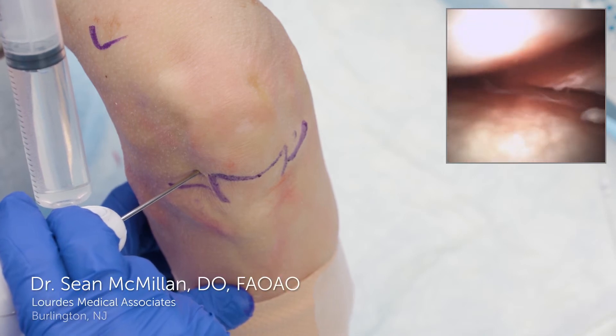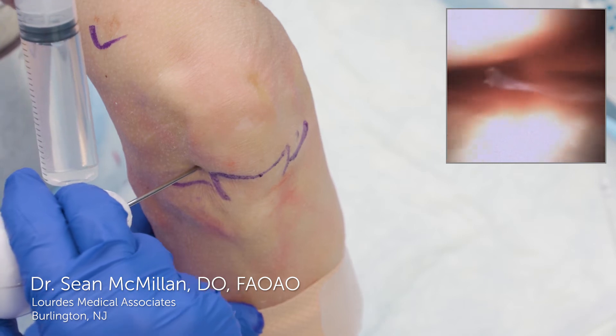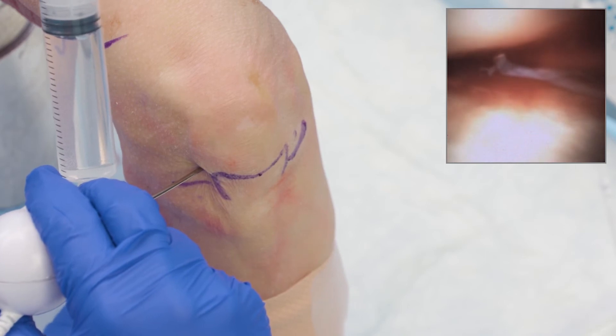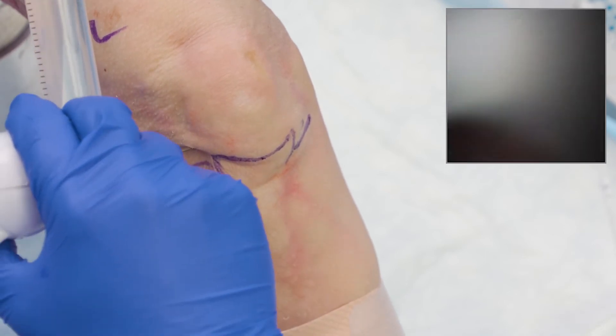When I want to get to the posterior horn, it's important to drive right to the little black triangle — the space that's there — and then I can start sweeping around to see my horn. Just like in real arthroscopy, movement of the knee and gentle movements from flexion to extension will create more visualization.